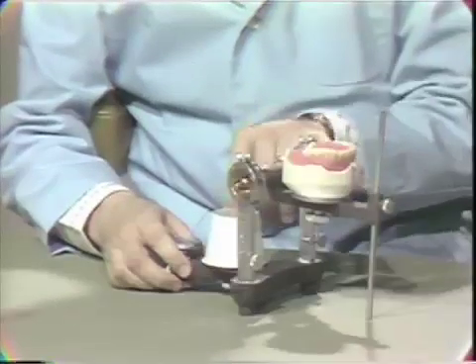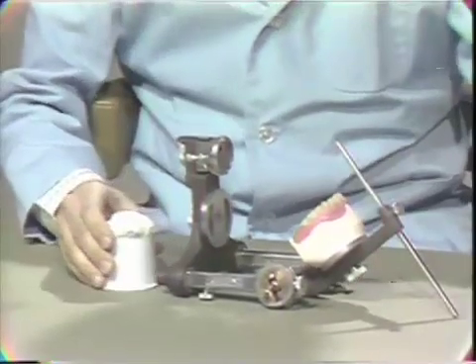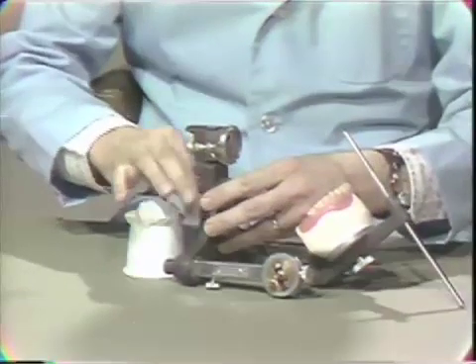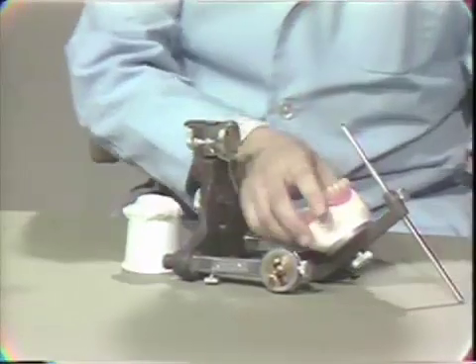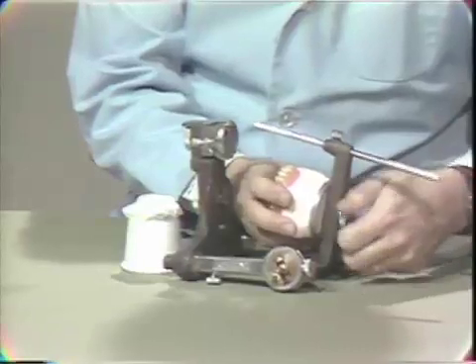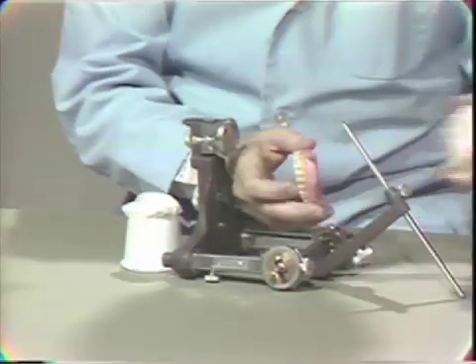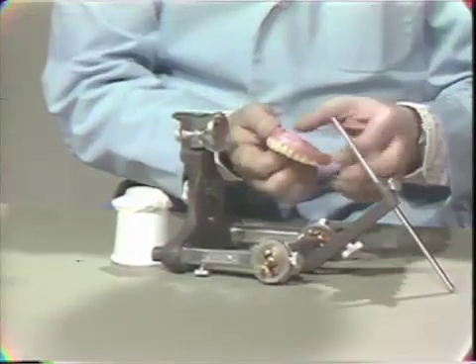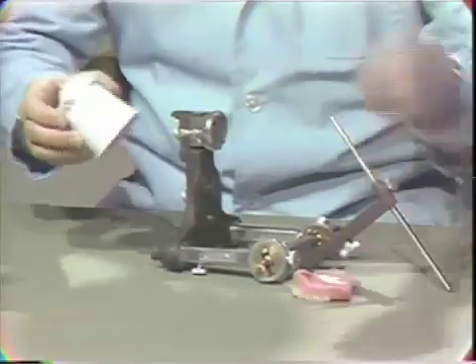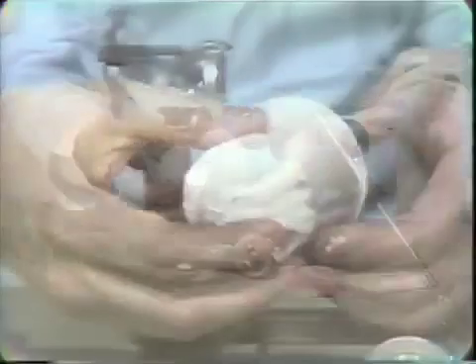Then the case is opened and the lower mechanism is taken off. Now I have made one ahead of time so what I will do here is simply show you how it goes back together. We'll take the lower off once again. And at this time, let's take the upper off because after that step, we actually processed the upper denture. So now let's consider this the processed denture that we have back. We want to put this back on the articulator correctly. Here's the mechanism that we just made to do this — very simple to do.